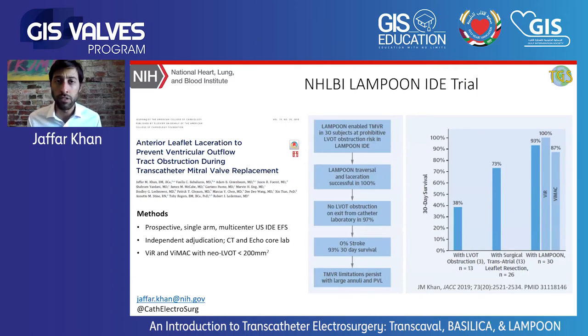The evidence comes from this early feasibility study we performed of 30 patients who are all at risk of LVOT obstruction. LAMPOON was successful in 100%, irrespective of calcium pattern or anatomy. And there was no LVOT obstruction on exit from the laboratory in the majority of these patients. There was no stroke at 30 days.